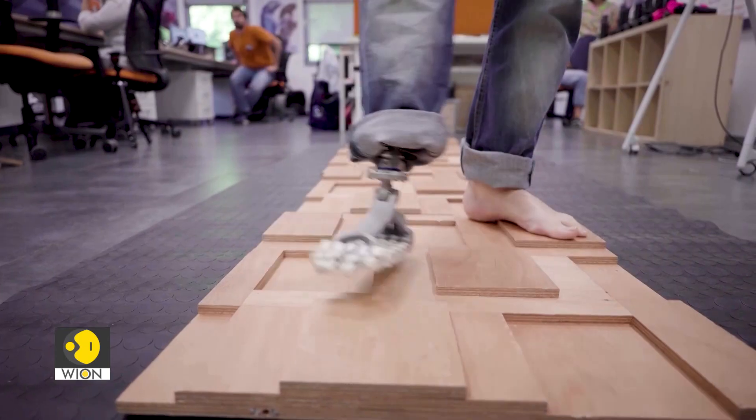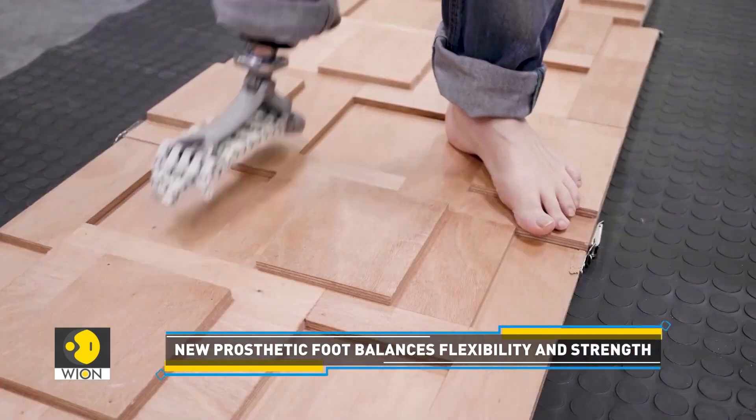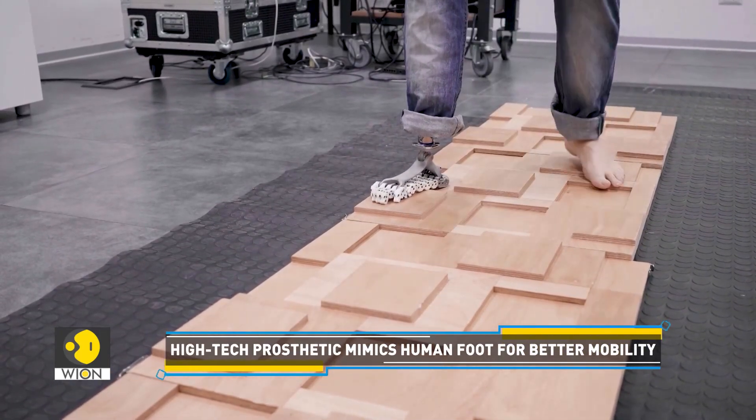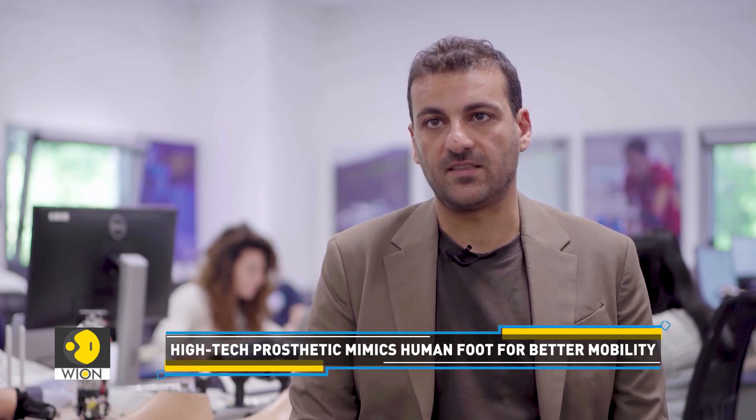We have a system of phalanx bones, ligaments and muscles that allow us to deal with every kind of environment. What we are trying to do is to replicate this, to translate this principle into a technology system that can be available for both humanoid robots and also prosthetic systems for humans.